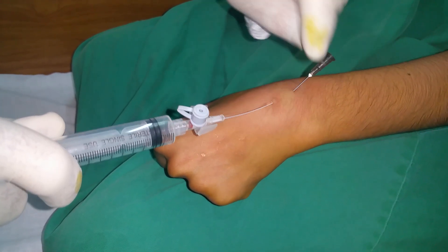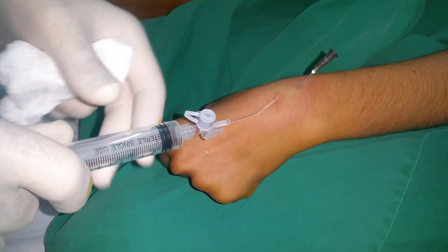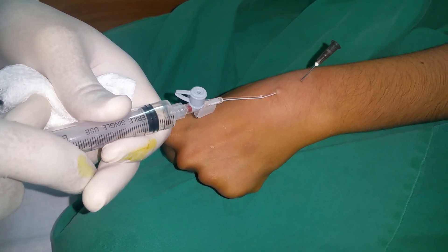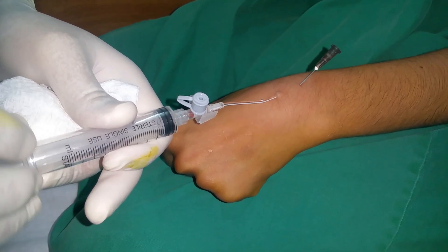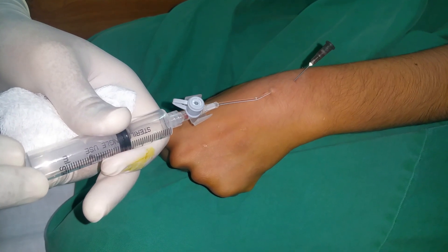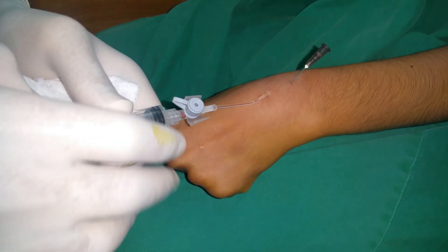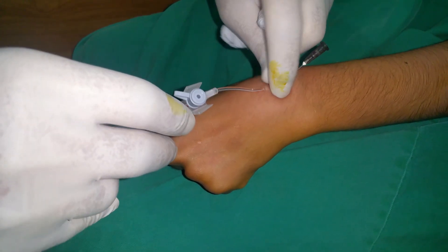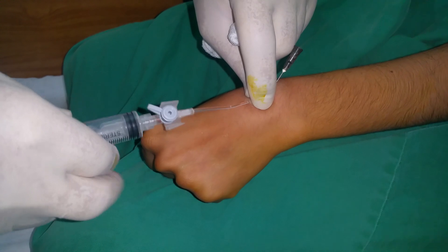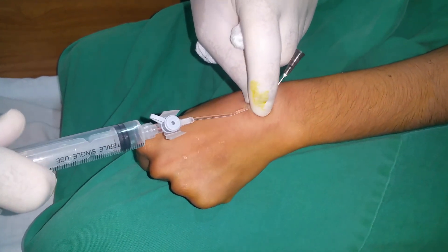It's a thick mucinous material and now the cavity has collapsed. This cannula is full of the mucinous content and this cavity, which was initially palpable, is now collapsed since it was a moderate size.